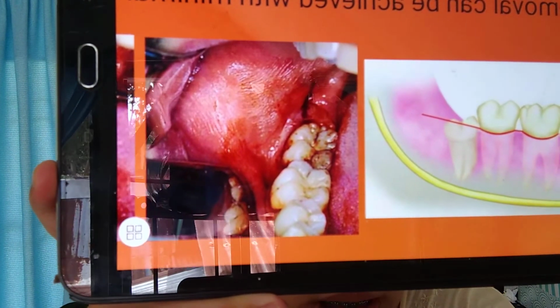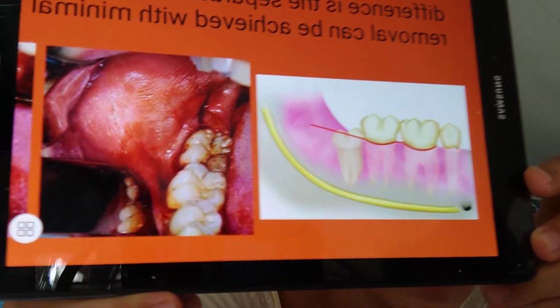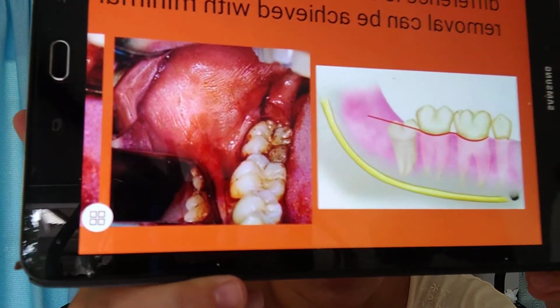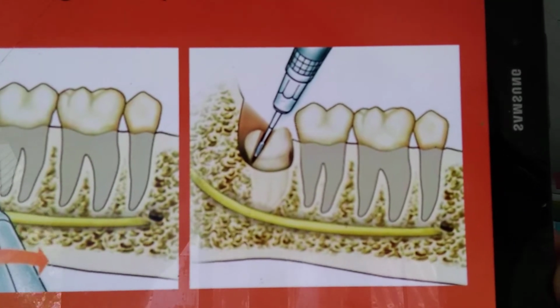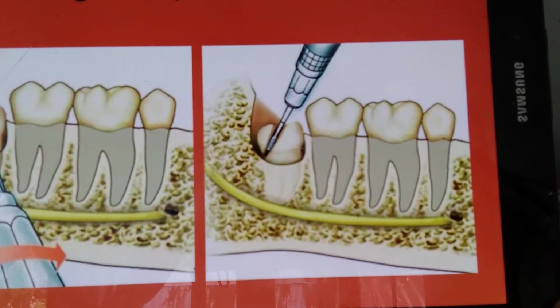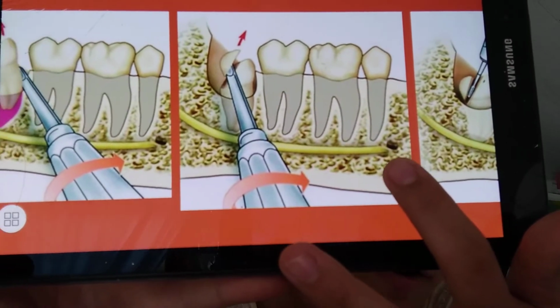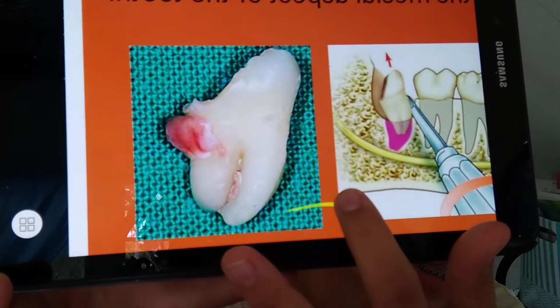and removing of bone is similar to that mentioned for the tooth with mesioangular impaction, and the only difference is the separation of the tooth, which is performed so that its removal can be achieved with minimal bone removal. More specifically, the distal portion of the crown is sectioned using a fissure burr and then removed, while the remaining segment of the tooth is then luxated after placing the elevator at the mesial aspect of the tooth.